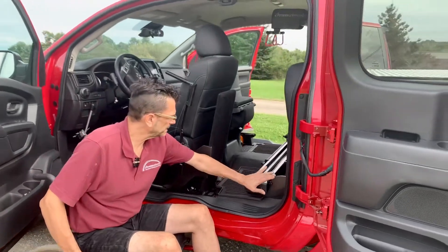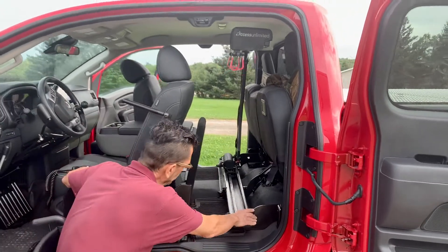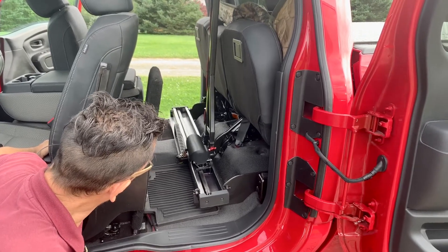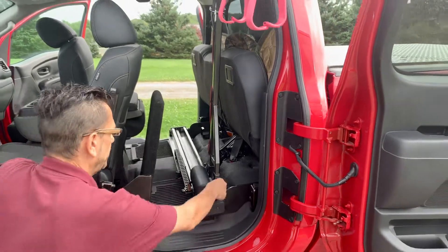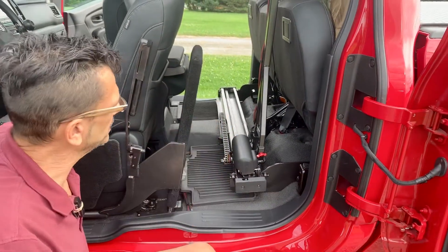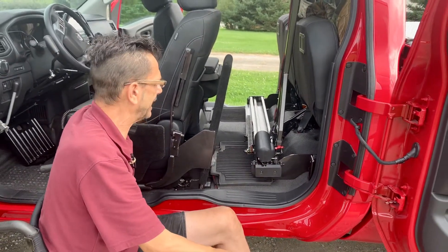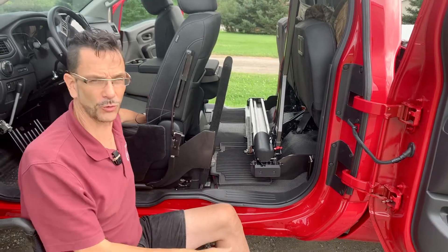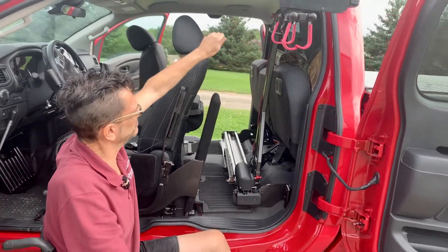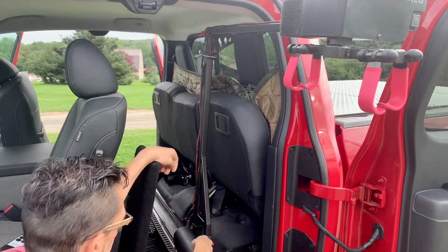The really cool thing about the mounting system over here is how we mounted this particular version of the Easy Stow. We'll run this out so you can get a really good view of how the unit operates — it runs along a gear mechanism. Right here you'll see a release and also some electrical connectors. The great part of this system is that it can be released and removed, so if you ever wanted to have your full seating capacity and have somebody else throw your wheelchair into the back, that gives you the option of having these seats flipped down for normal seating capacity. Or if you've got a lot of stuff you want to put in the back and don't want this mechanism in the way, there's a release — you undo that screw, pull out the pull pin, and this whole unit will collapse down.